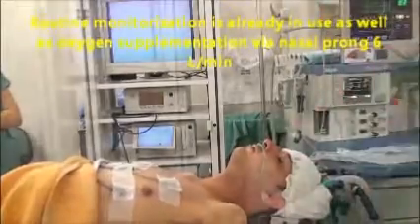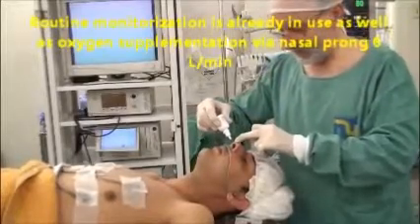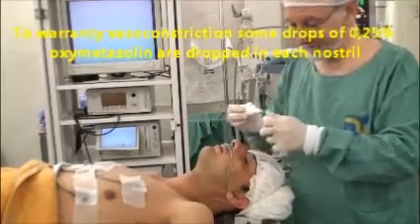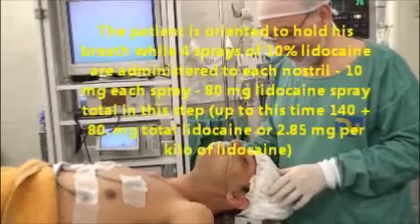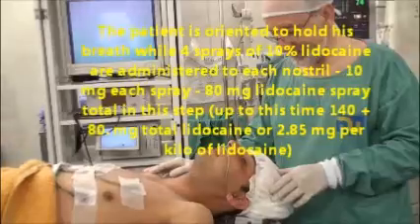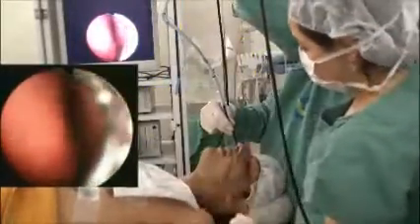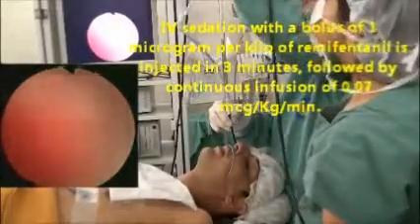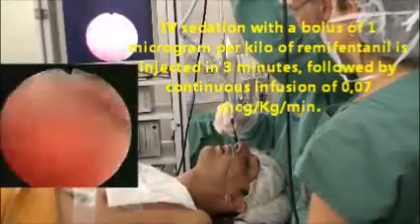We add some 2% lidocaine gel in order to provide lubrication, and some extra drops of oxymetazoline to provide good vasoconstriction and avoid bleeding. At this point, the infusion pump administered to the patient, in 3 minutes, a bolus of 1 microgram per kilo of remifentanil, and the infusion continues at 0.07 micrograms per kilo per minute.